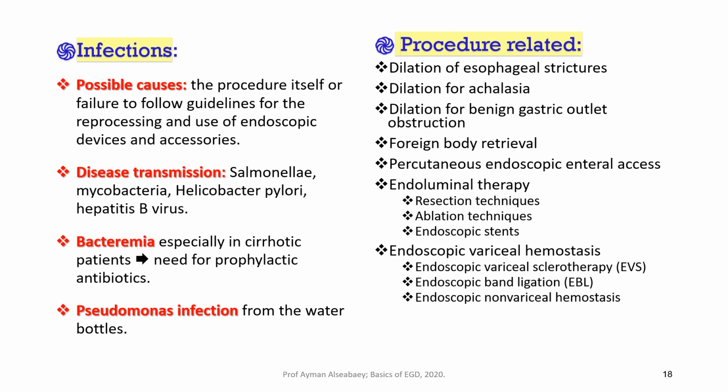Infections. Infection is also not common with diagnostic upper endoscopy, and if you follow the good sterilization protocol and the reprocessing protocol, the risk of infection is very, very low. In the past, one of the most common sources of infection was the water bottles. They were a source of infection with Pseudomonas.